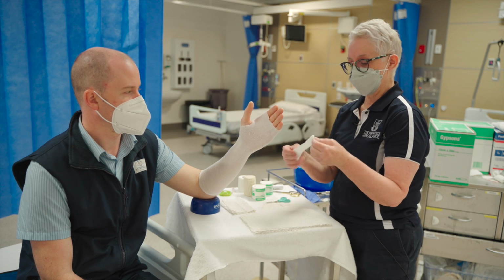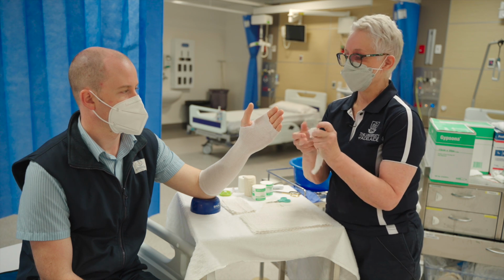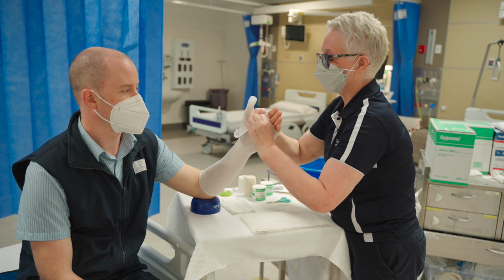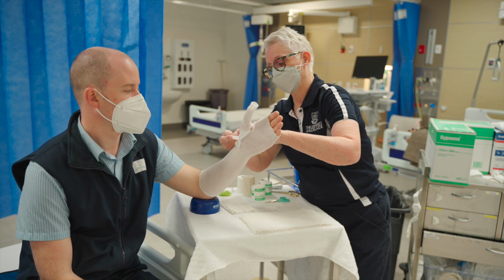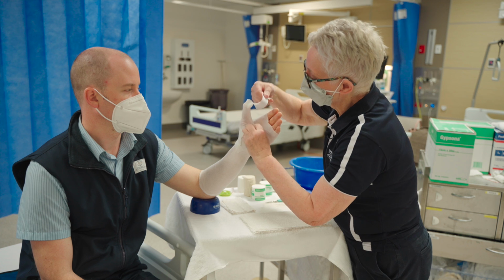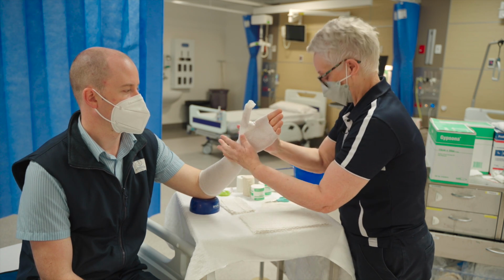Next we take our thumb piece and we've cut a little piece down the side, like so, to make sure we've got the wider bit at the bottom. And we slide that over the thumb. We take our tape and we secure that piece to the stocking net, making sure we've got no open skin on view. We don't want to stick the plaster onto the skin.